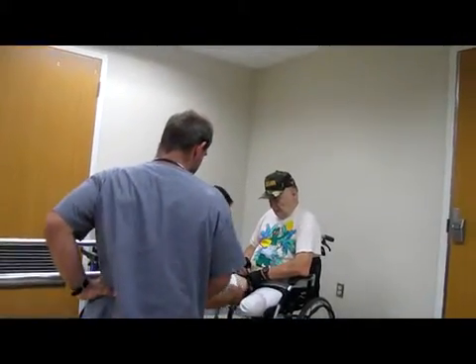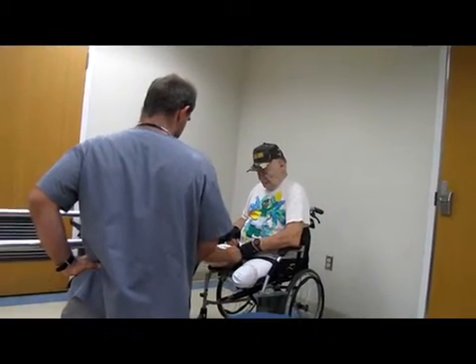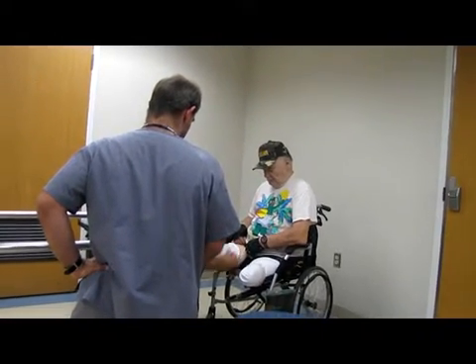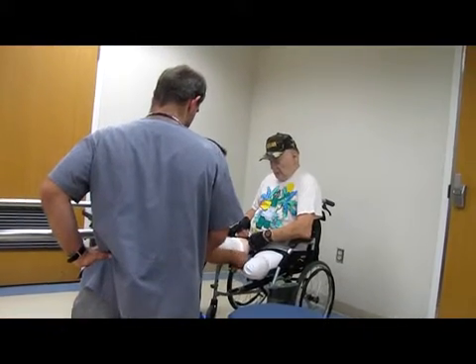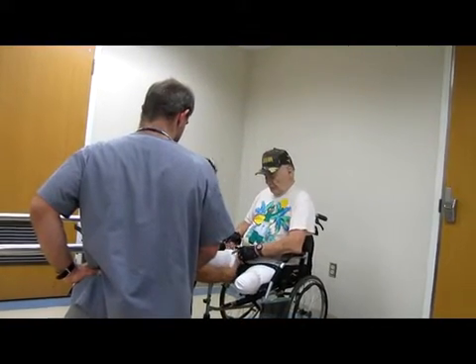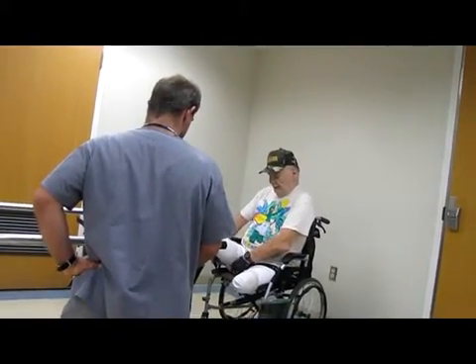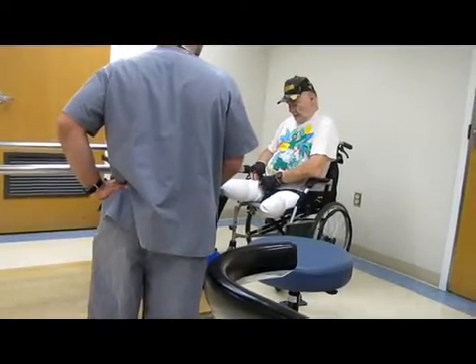It seems to be larger. I don't know if this is going to be the right size for you still. Or honestly, even if you need these socks, they may stay on by themselves. His other prostheses did, basically. Before, I think the right one was tight, and we were surmising that perhaps we'd have to go with just a nylon type thing, if we put anything on the leg, because it was tight without it, bare naked. So this may in fact be a little too much here.